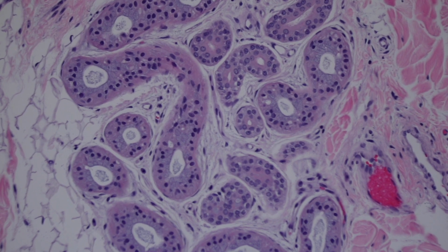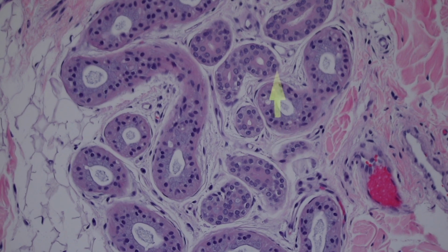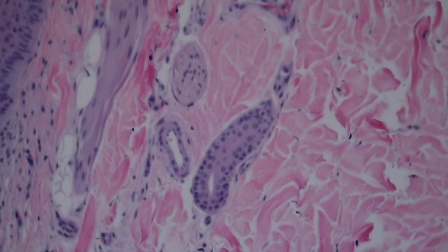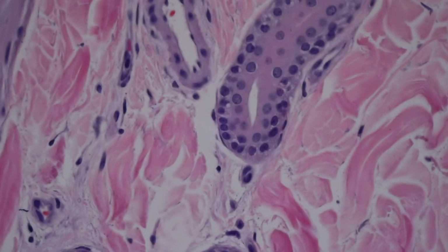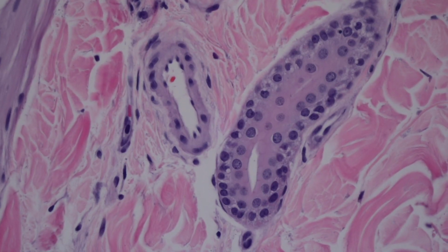Now, I know you have to use your imagination to think that these are square, but they're not taller than they are wide, like a columnar cell would be. So you can see that they have these round nuclei, and there are two layers of them. I think you can best appreciate the double layer here in the duct. So you can see the double layer here.